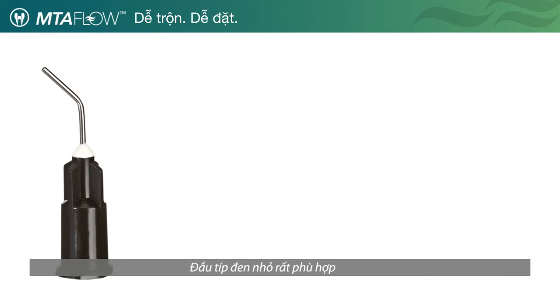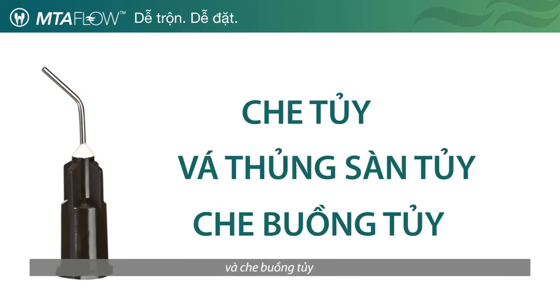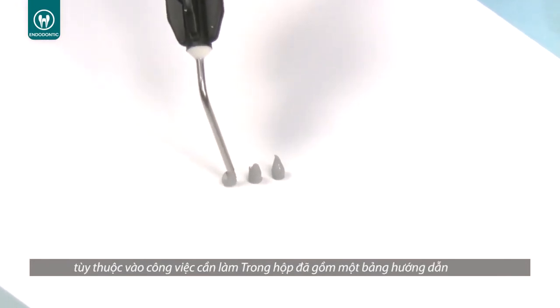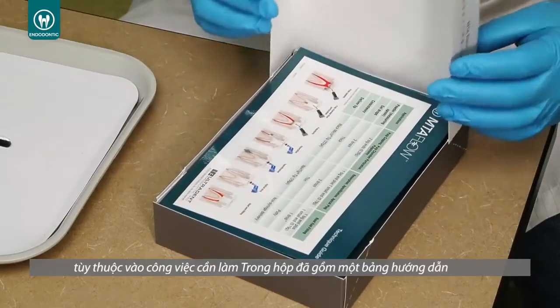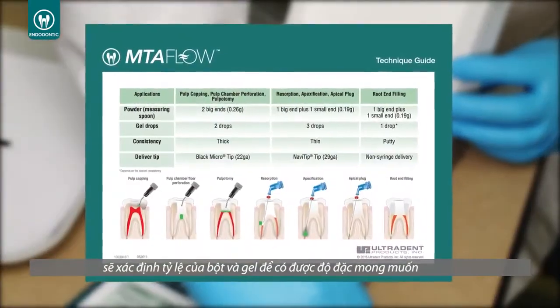The black micro tips are excellent for pulp capping, pulp chamber perforation, and pulpotomy. The mixing ratio of powder and gel components of MTA Flow is adaptable based on procedure. A guide is included in the kit which will define the ratio of powder to gel to obtain the consistency desired.